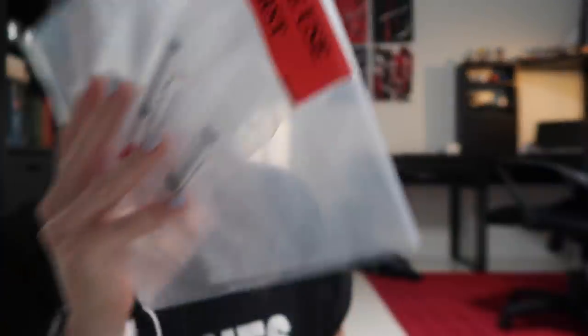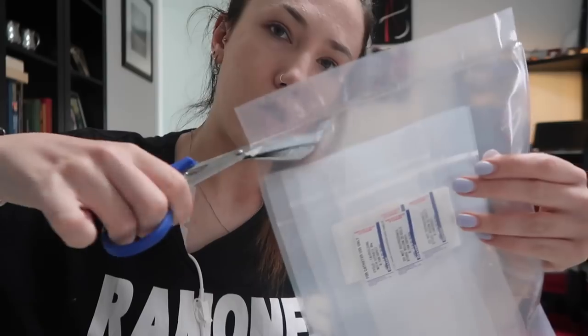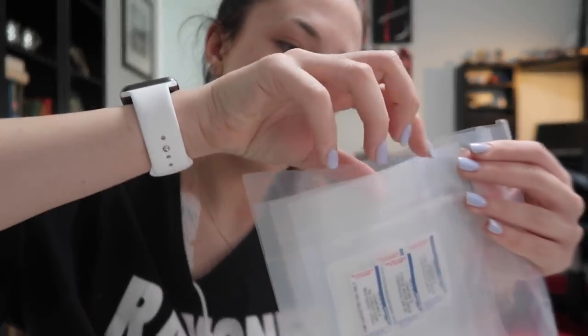Next we are going to put away the Taurolock. This is labeled 'please use first' so I'm going to make sure I put this one on top. They're in a bag inside a bag so first things first we just cut these open. Then I basically grab the chunk of these - this is going to go in the second drawer down. I'm just going to put all these together with the oldest ones on top, and then put this new batch on top of that because these ones need to be used first before any of the others.